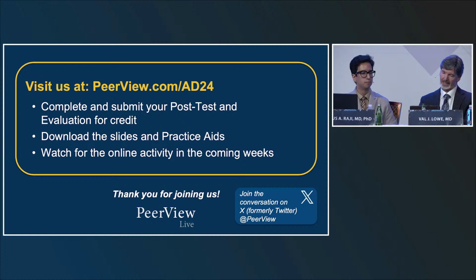How do amyloid PET and tau PET compare to FDG PET with respect to sensitivity and specificity for making an early differential diagnosis of Alzheimer's disease? So, we've got a lot more experience with FDG PET, and one thing that FDG PET shows is clinically affected areas of the brain, right? So, in a sense, that's somewhat non-specific because it can be related to different pathologies that may involve those same regions. So, if you have to say which of those is the best, it really is tough because you need to have pathologic and very specific identifiers, which you get with amyloid and tau PET.